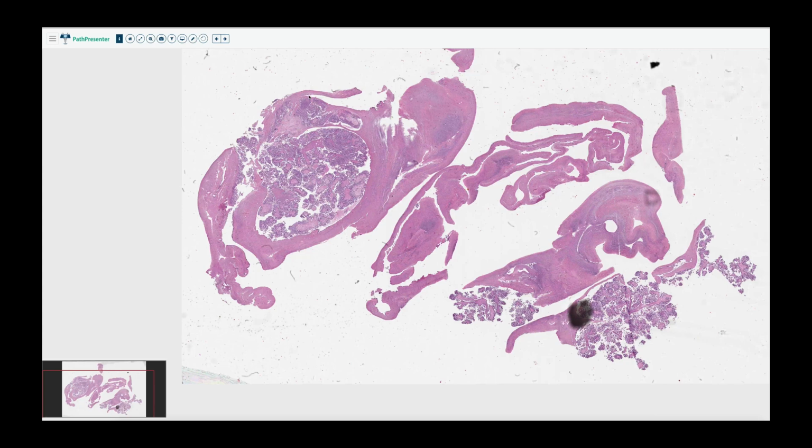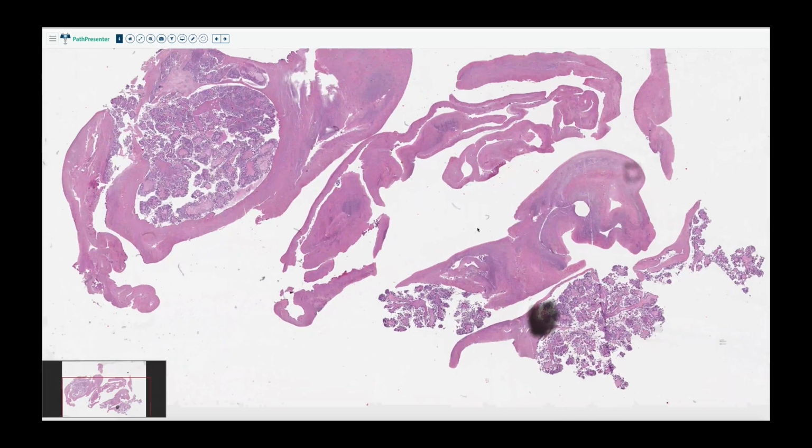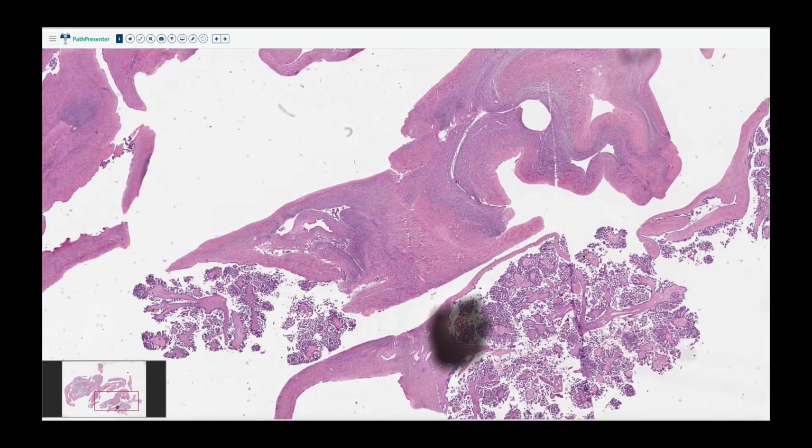But the other thing that's interesting is that this one here in the left upper hand corner is mostly intracystic. So if you weren't carefully sectioning to find these and just sort of pat along the top and making big sections, you might miss these. They might be hiding inside of a cyst. So always keep in mind that ovaries can be tricky. Assume that you have to really get in there and look hard.